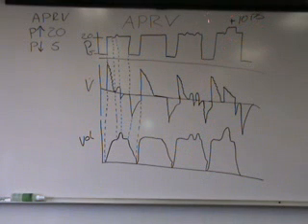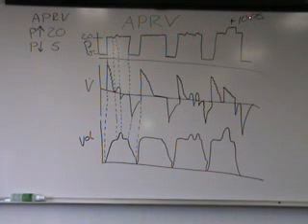On this last breath, I've added 10 of pressure support, because we can add pressure support with any mode of ventilation that allows for spontaneous breathing, and obviously airway pressure release ventilation does allow for spontaneous breathing. So here I've added 10 of pressure support. If I were to bring this over to my graphics package, I would see that the peak inspiratory pressure now is 30, which would be dangerously close to an alveolar pressure of 30. But for illustration purposes, it'll do just fine.